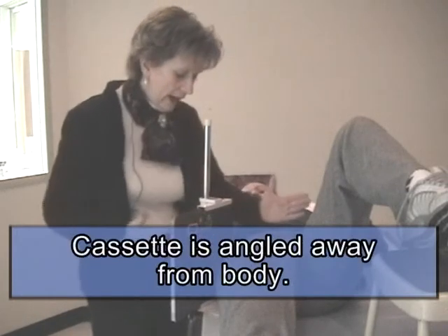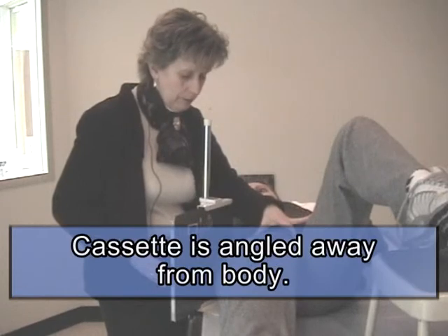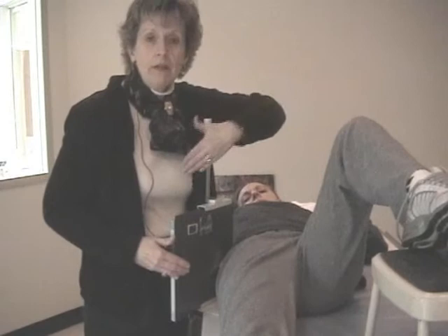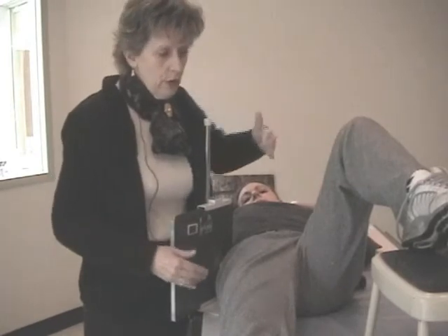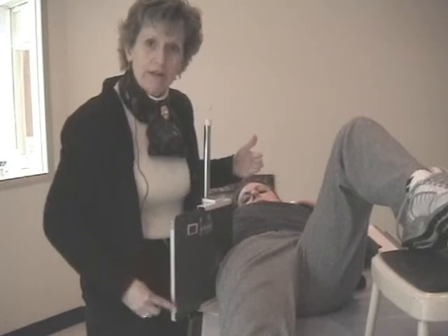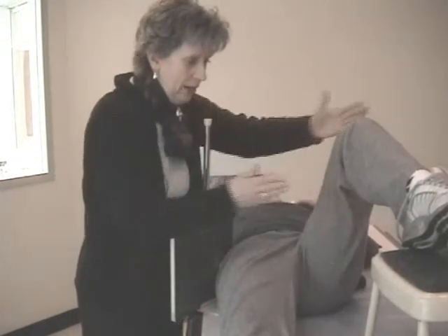The cassette is angled away from the body until it's perpendicular to that imaginary line. You have 40 inches. Again, you might not be able to get 40 because of the tube setup, so you just use the density maintenance formula. You have your tube centered to the grid this way, and the way you did that was the 5.5 inches. And you have the cassette parallel to the tube.